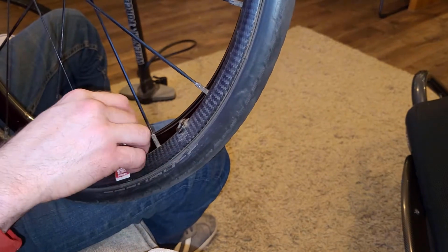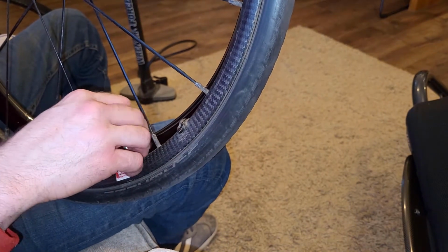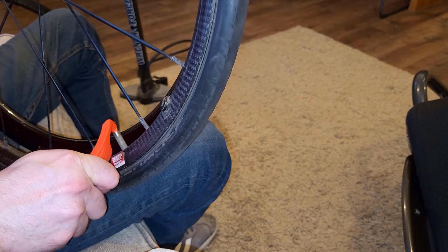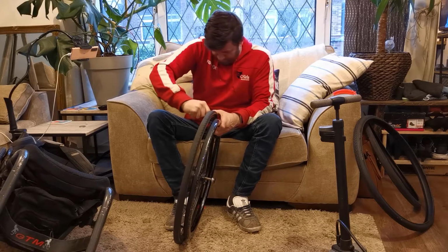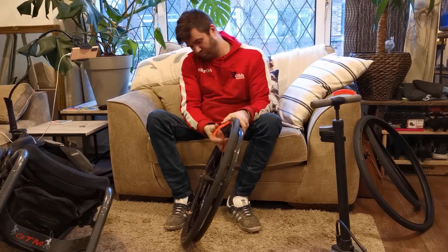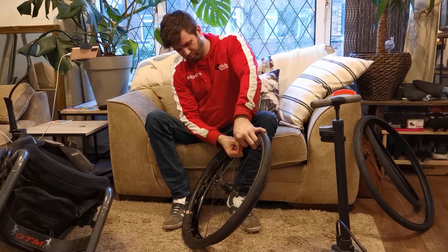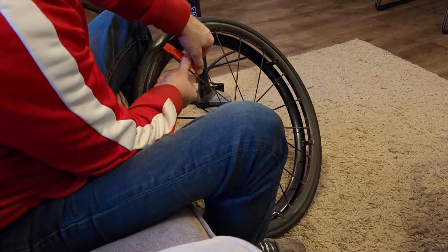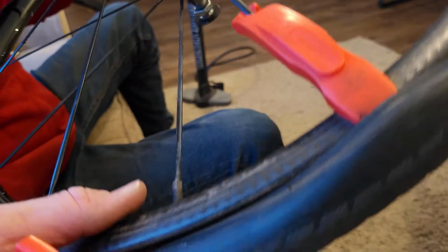Here you can see it's a standard car tyre valve, a Schrader valve. I also have Presta valve tubes on some of my sports chairs, which can hold a higher pressure. Just going to release the air from the valve, and then using the brand new tyre levers, I'm just going to slip off the tyre. Now you can see there's a hook on the back of the tyre lever here, and that's to help keep the bead off the rim as you're taking it off.